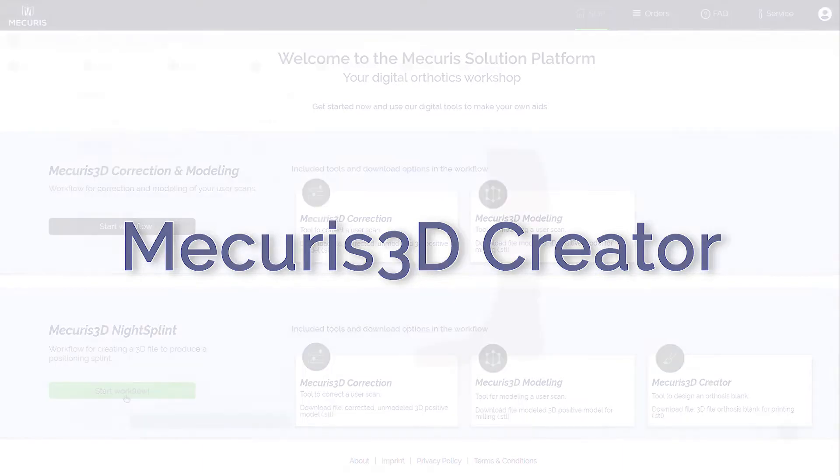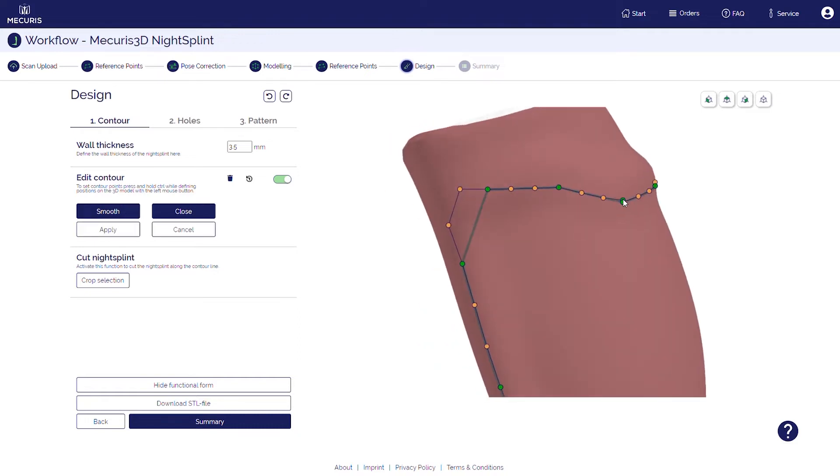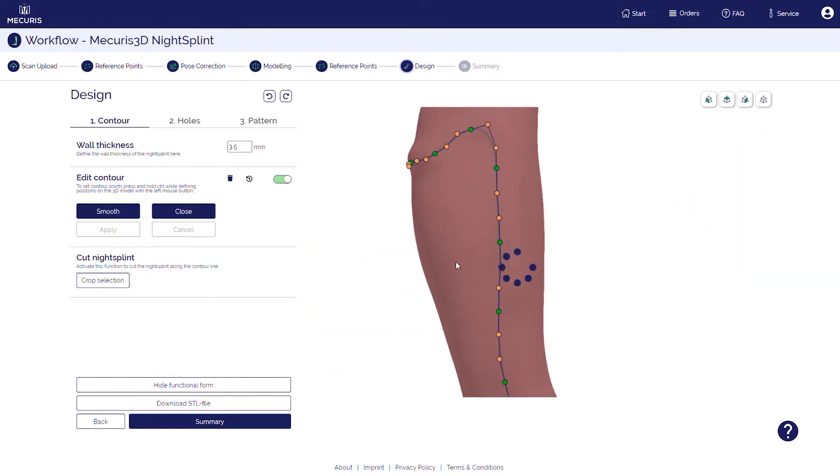With the Mecuris3D Creator, you can digitally create an orthosis blank. For that, you simply determine the course of the edge and select the part of the orthosis that you want to keep.